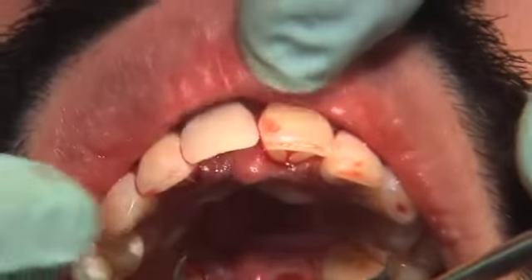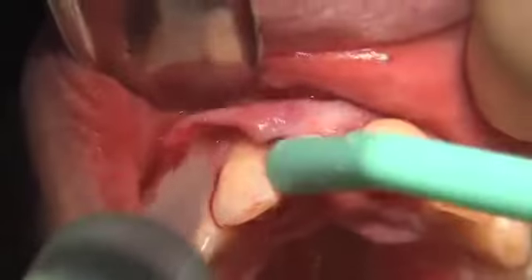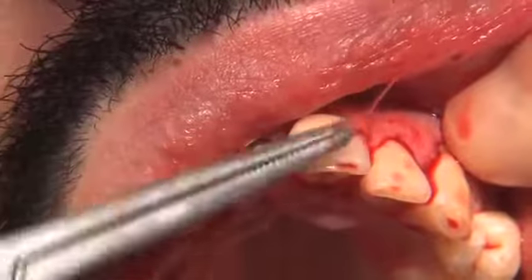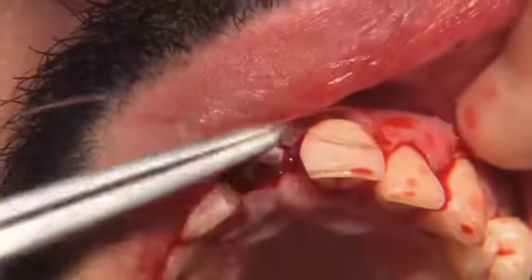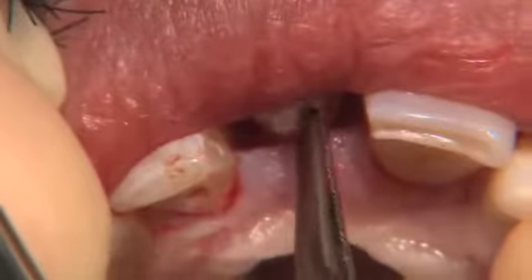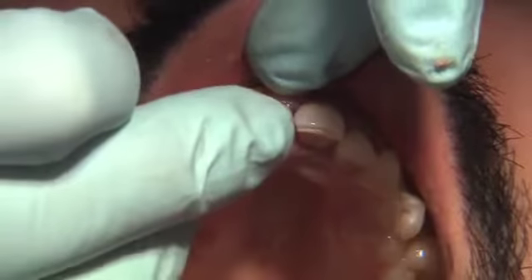Once any necessary adjustments have been made to the temporary, the soft tissue is irrigated copiously underneath the flap to ensure no hard or soft tissue debris remains. And the papilla and flap is reapproximated on the adjacent teeth, leaving the site directly around the osteotomy still flapped. The cover screw for the custom temporary abutment is sealed, either with Teflon or in this case cotton pellet, and the biotemp is delivered with the temporary cement of choice.